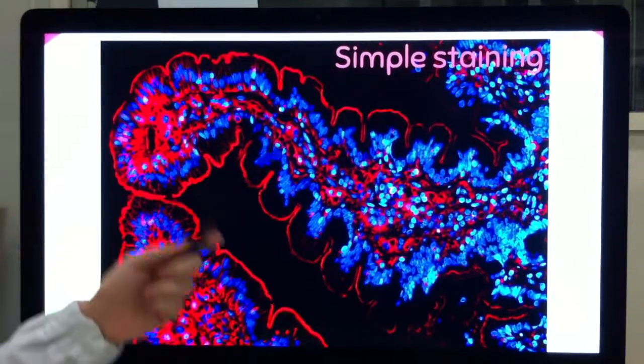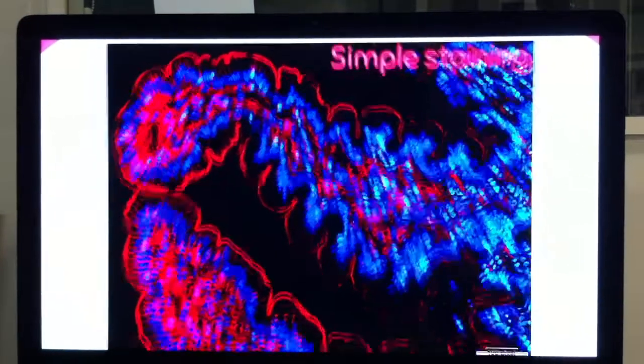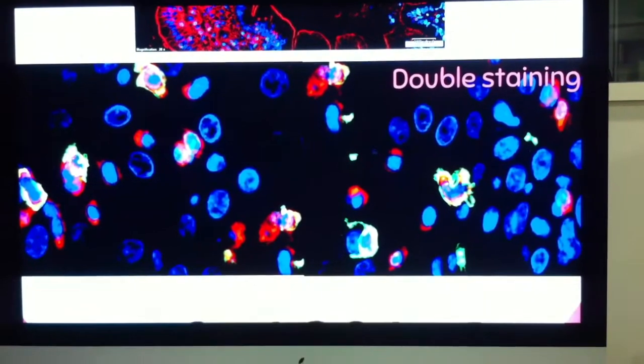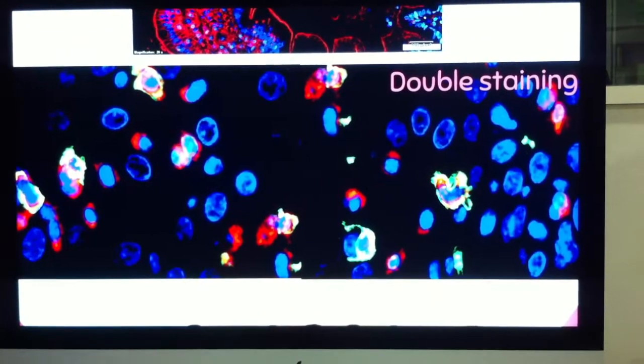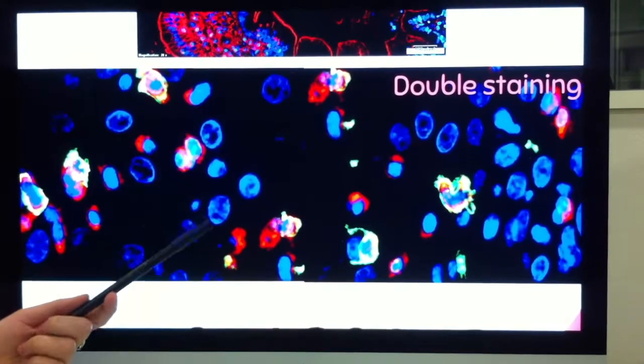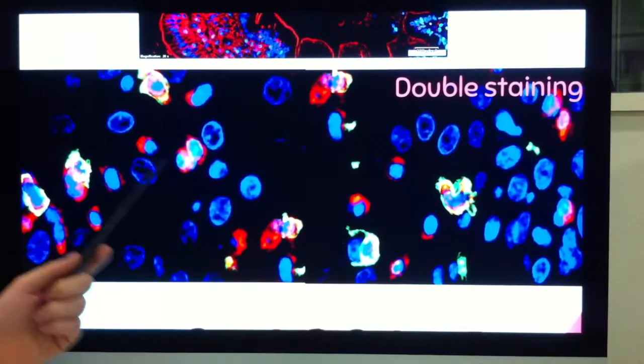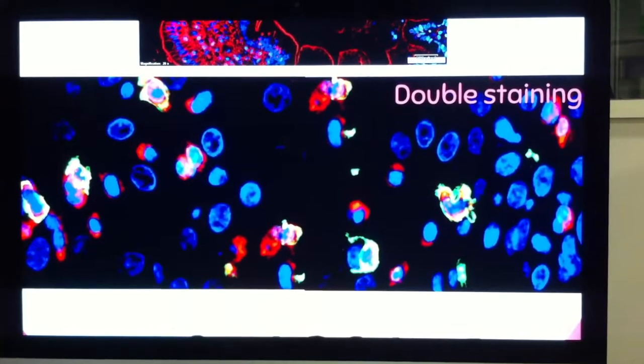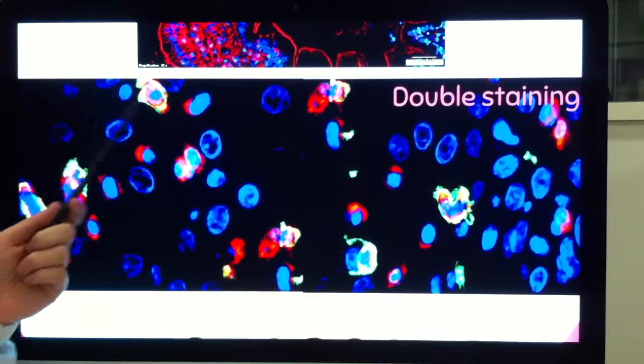We can also see staining between cells and in the cells of the lamina propria. We can also perform a double staining in which we look for two different proteins. The ones in the picture are membrane proteins, and we can see single cells in red and in green, but also double-expressing cells shown as a mix of colors.